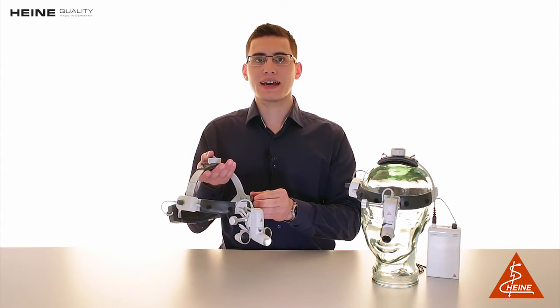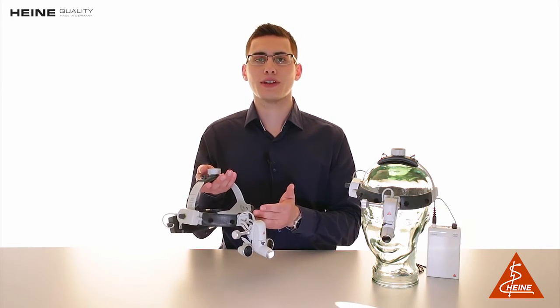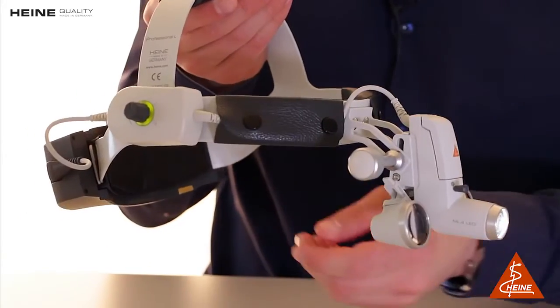The ML4 LED is the ideal option for prolonged procedures due to its comfortable and secure fit. A professional headband offers multiple adjustment points and soft padding.